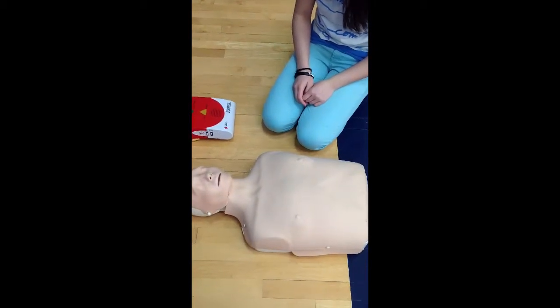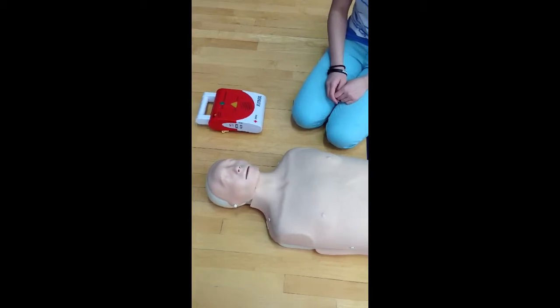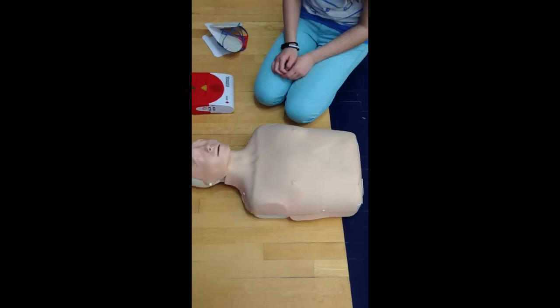So let's take a closer look at what we just did without the AED on. So when you get the AED, you immediately want to turn it on, and then don't actually press it.